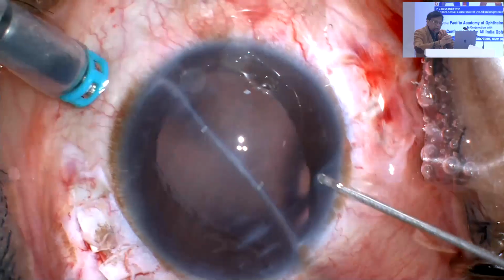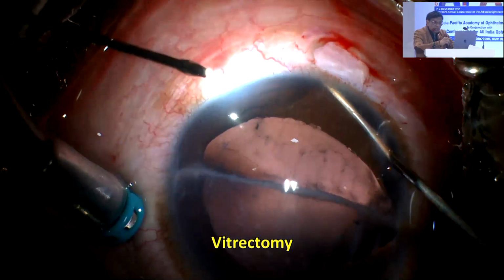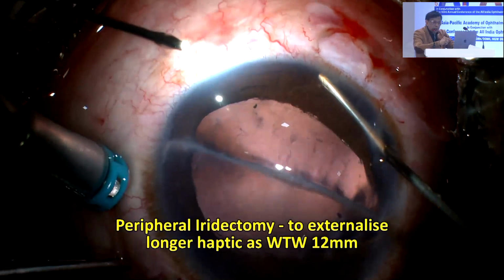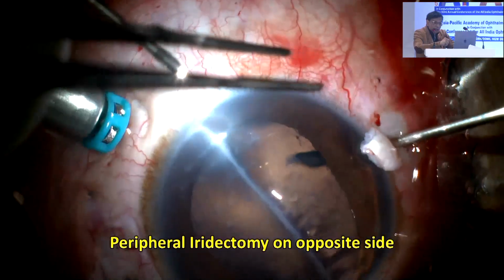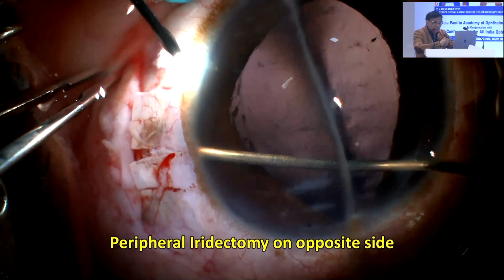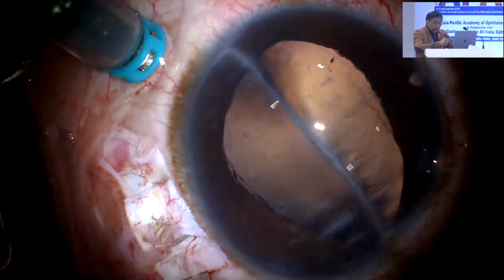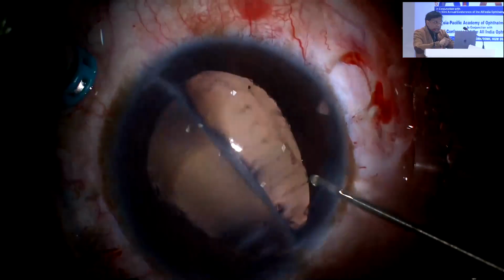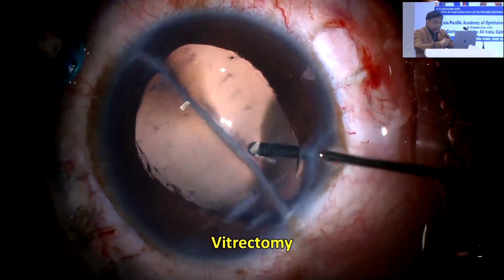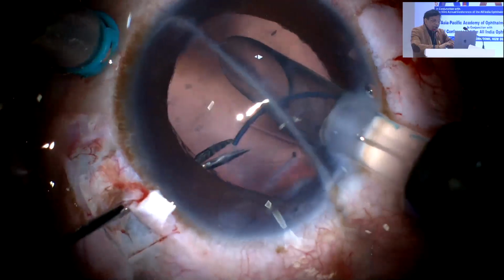So once I have made my scleral flaps, obviously I'll need to fix an IOL in this case. But in this case, what I wanted to show you here is, look at the peripheral iridectomy which I'm doing there. Once I have done that, I now go in, make my sclerotomy on either side. Once that's done, I will fix the glued IOL. Here you can see now, I've done the vitrectomy, I've got fluid going inside the eye. I make my main port, apply my vitrectomy probe there.